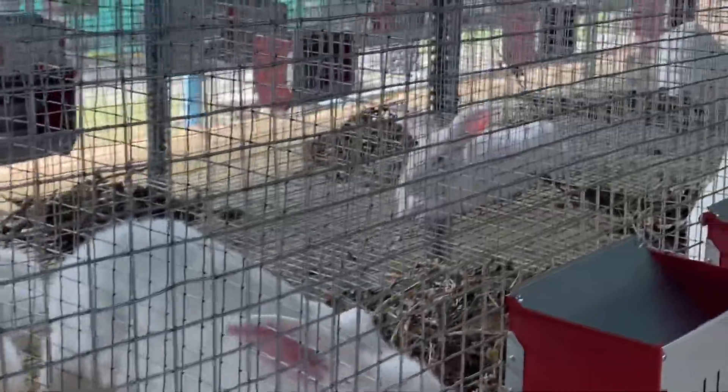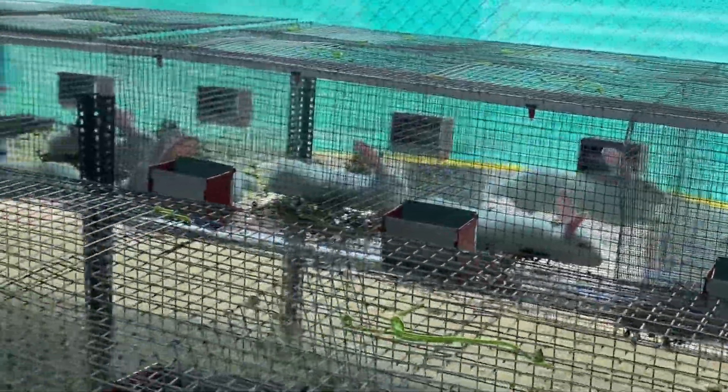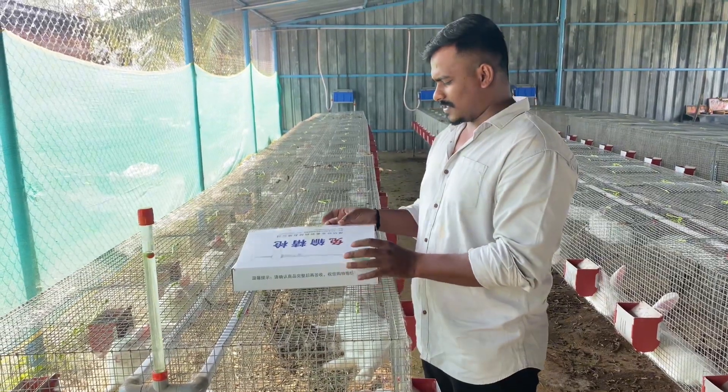Hi friends, welcome to Web Indian Rabbitry YouTube channel. We are going to explore artificial insemination in rabbits. In this video we will be unboxing an artificial insemination kit and explaining the things which are used to do insemination.